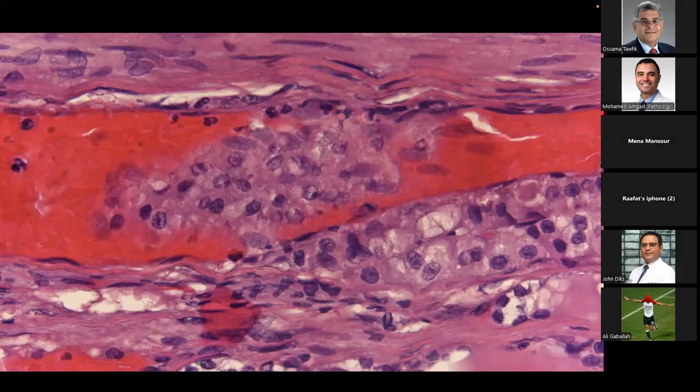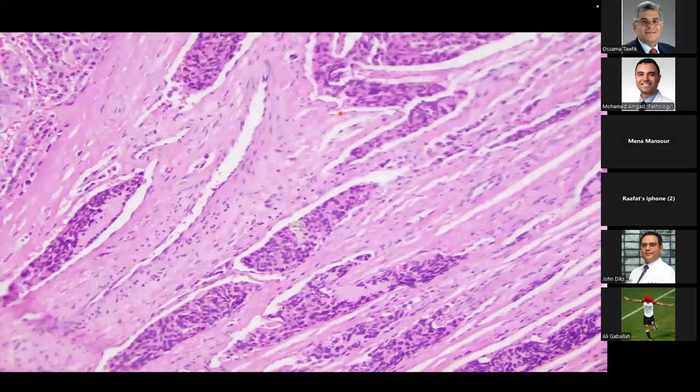We can argue if it's connected to the wall or not, or something like this, for example, where you have all these vascular spaces with tumor kind of hanging out in there without fibrin around it or anything like that. What do you do with it? So you see these things and you can't make up your mind. You get levels, you do everything you can, and you can't figure it out. And the most important thing: you sample this lesion as much as you can.